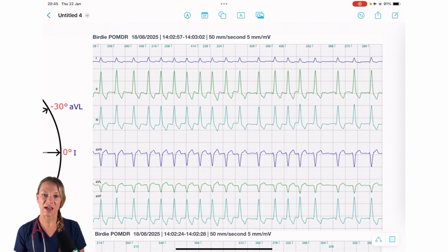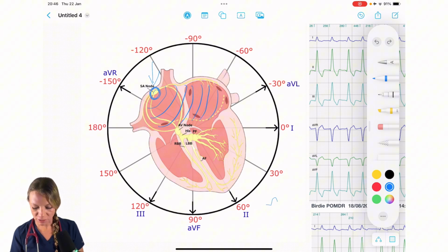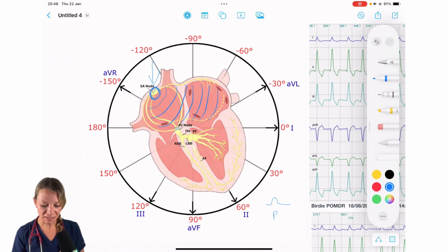But before we dive into atrial fibrillation, let's recap what normal atrial activation looks like. In normal sinus rhythm, electrical activation begins in the sinus node. The wave of depolarization spreads across both atria, and that organized atrial depolarization produces a single P wave. That impulse then enters the AV node and slows down briefly. Then the impulse spreads through the His-Purkinje system, activating the ventricles regularly and predictably.